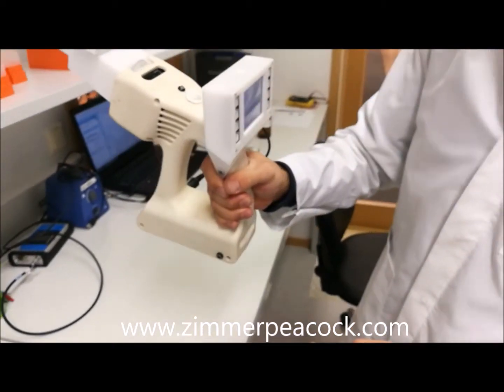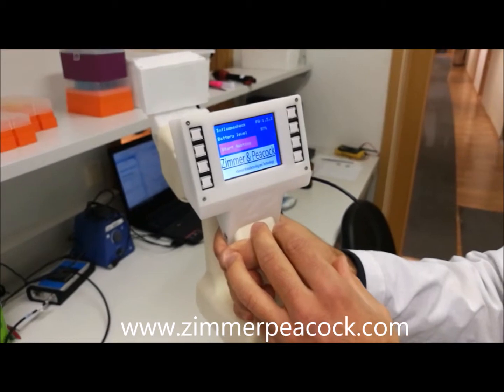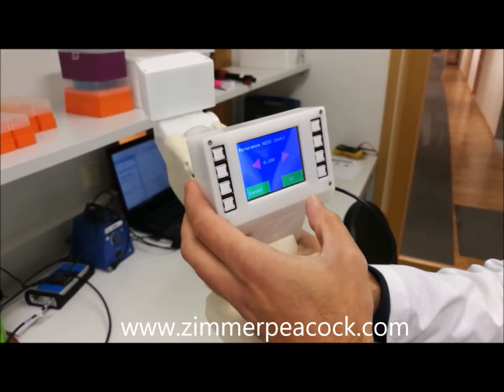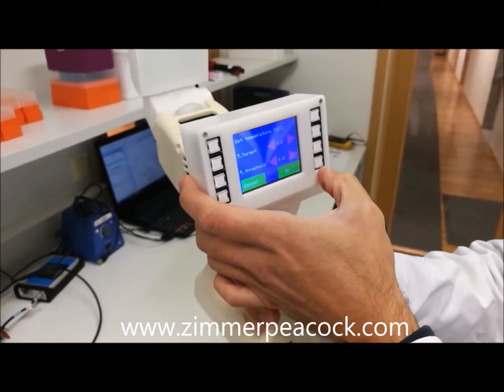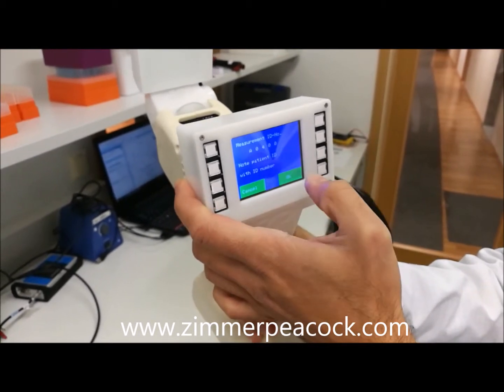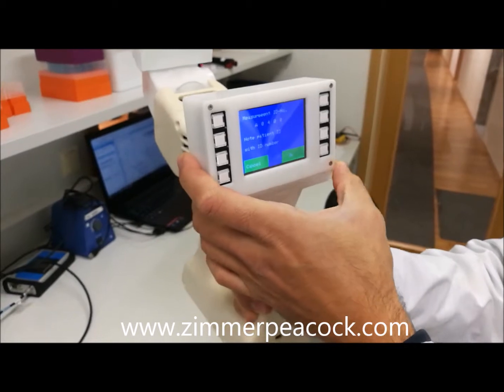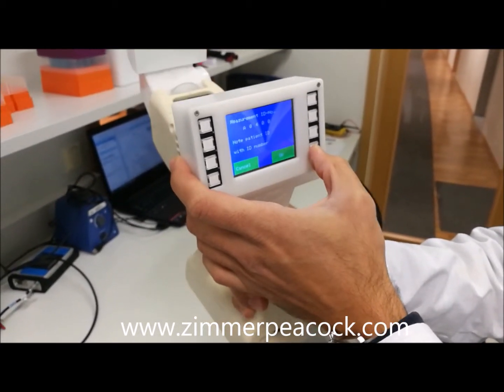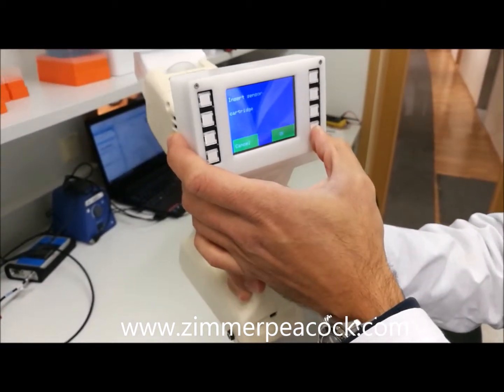I'm going to turn on the system and start testing. You can have two versions — with or without a touch screen. We have to control the temperature in order to collect liquid from the breath. Here is where you put the patient's ID — I'll just leave it as it is.